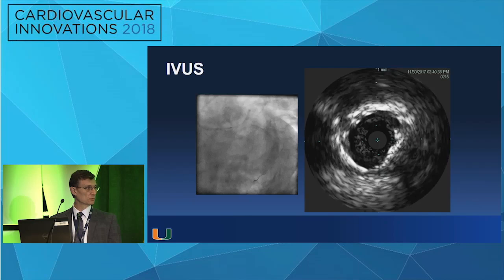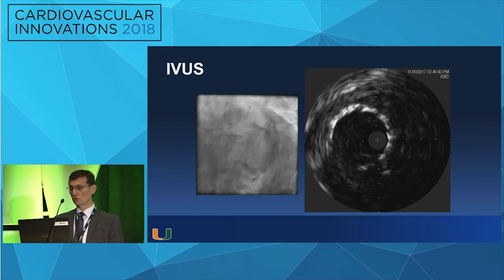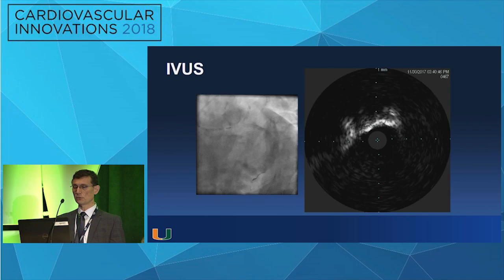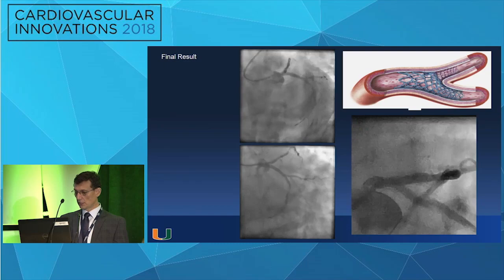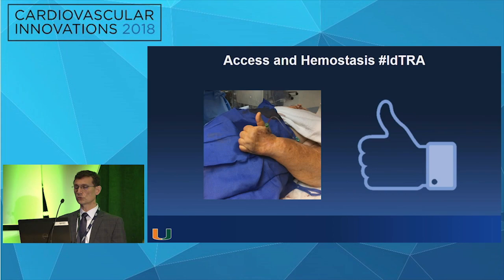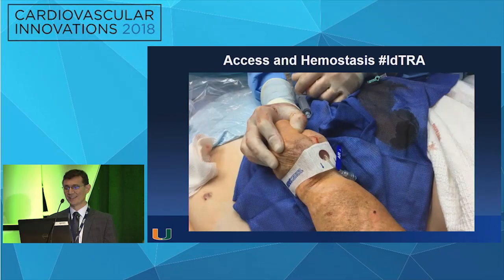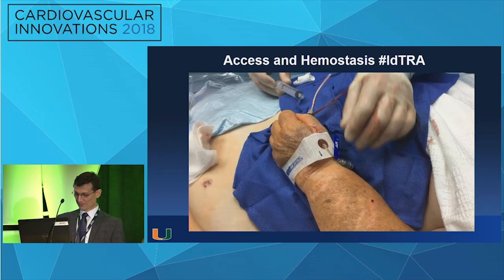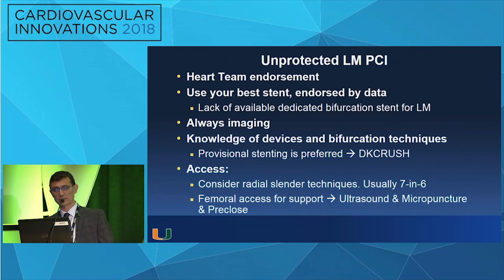We then re-POT to ensure good stent apposition and expansion in the proximal segment. This is the final IVUS - even though it's hard, sometimes you can't expand as much as you want because these vessels are really calcified. We covered all the way up to the ostium. These are the final results and the patient did well. Interestingly, this was my first left distal TRA case, because the patient was obese and ergonomically it would have been hard to do from left radial. We used the snuff box approach - hemostasis is very simple and patients and staff really like this approach.